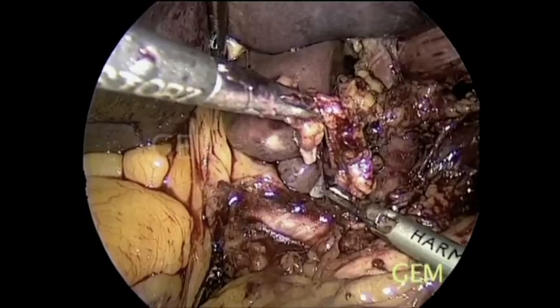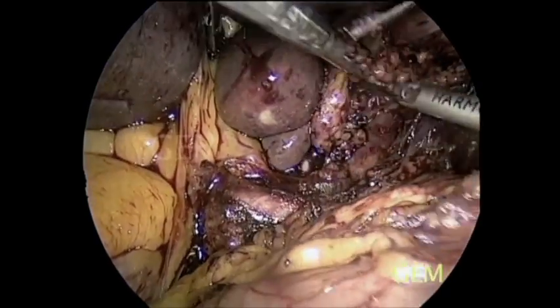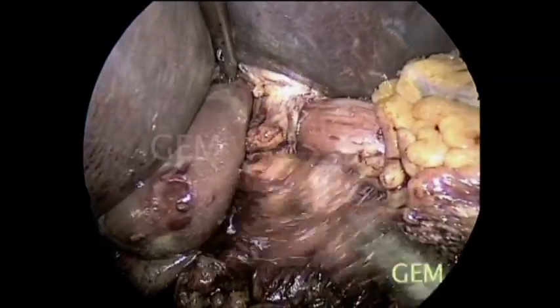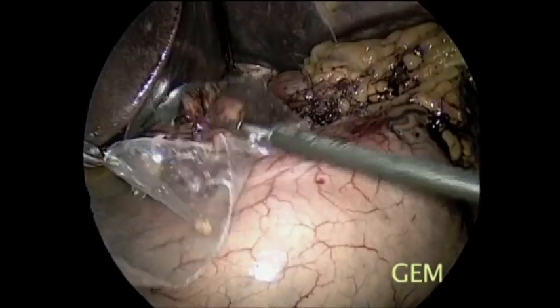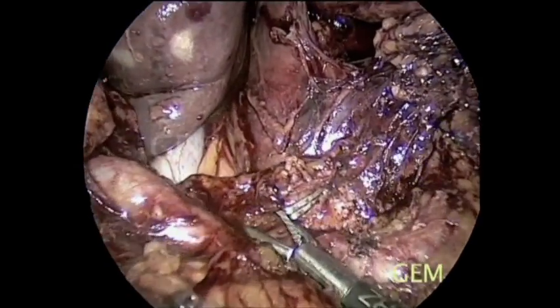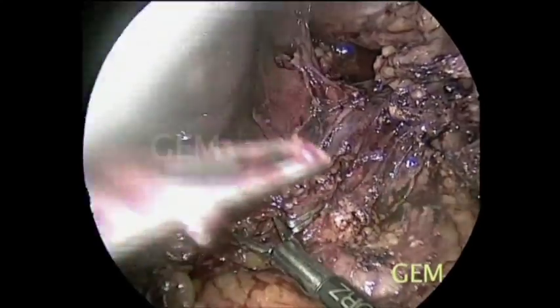This is the common hepatic artery. We pick up the nodes and place them in a bag to take out individually. Here we can appreciate that we use self-made bags, not commercial bags. This is the common hepatic artery and celiac axis.